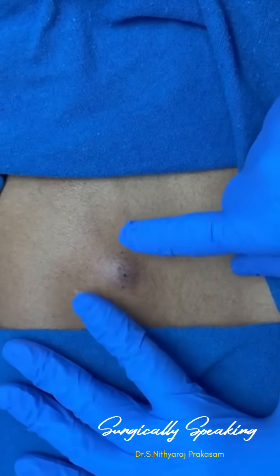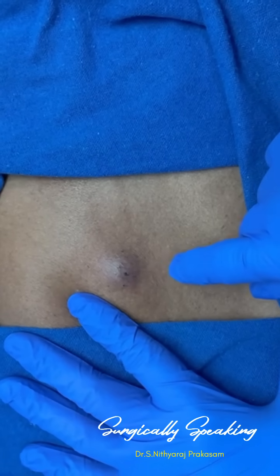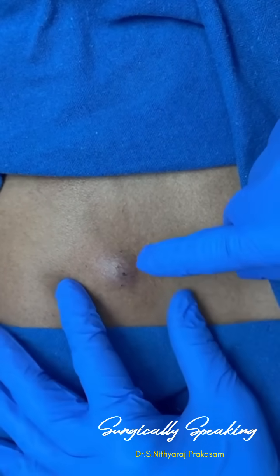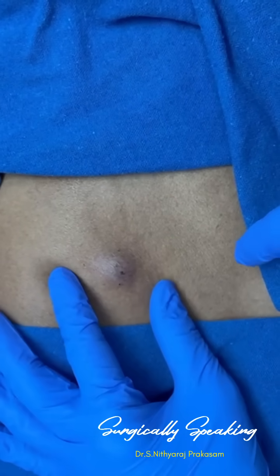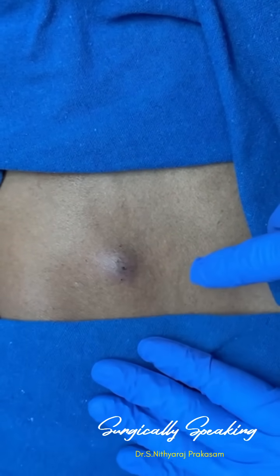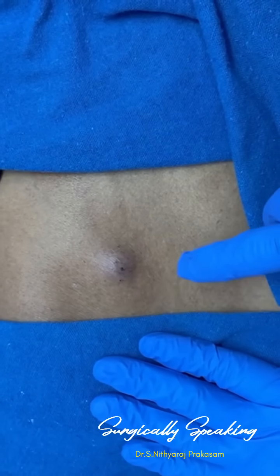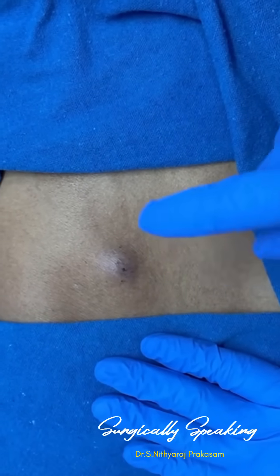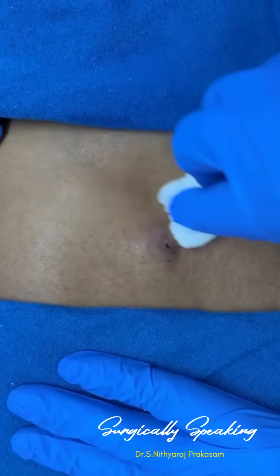The treatment for an infected sebaceous cyst is incision and drainage, not an excision, because excision will not be possible when there is infection in a sebaceous cyst. So now I'll demonstrate how I do an incision and drainage for this infected sebaceous cyst. Now I am cleaning it with a little sterilium.